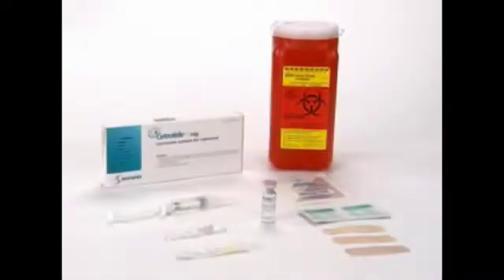Make sure you have all the necessary materials assembled in a clean area. You will need one vial of powder, one pre-filled syringe, and one yellow mixing needle, 20 gauge, 1½ inch.